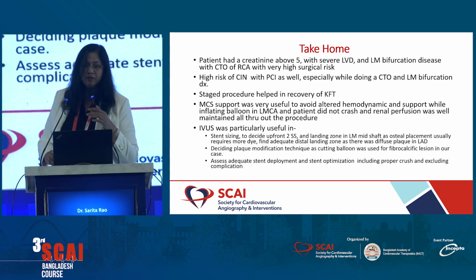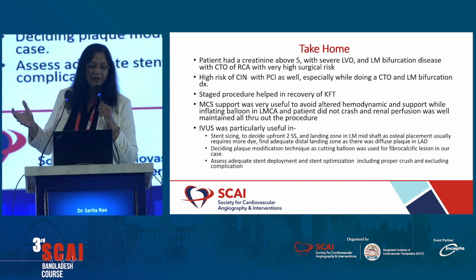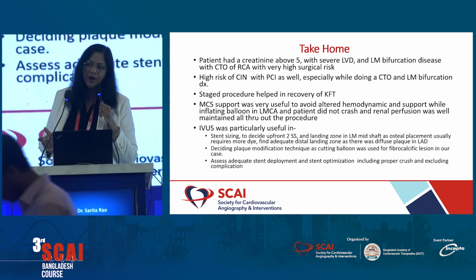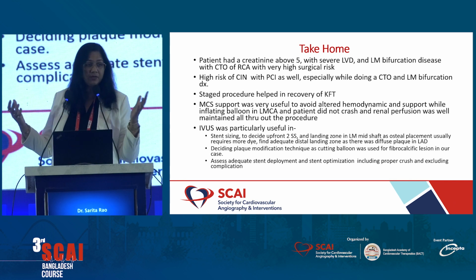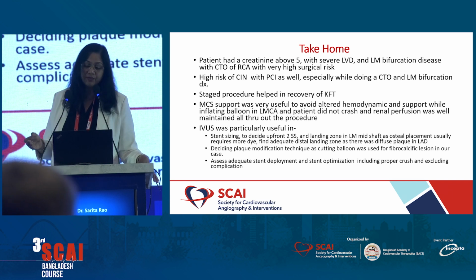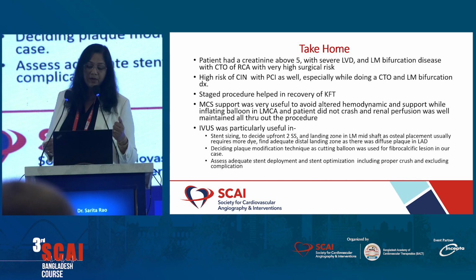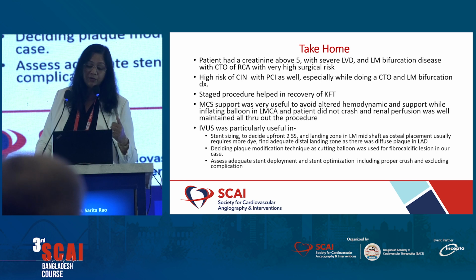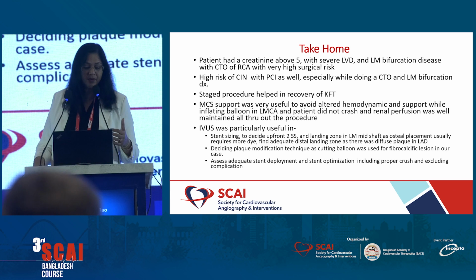So, this patient had a creatinine of above 5, severe LV dysfunction, left main bifurcation disease, CTO of the RCA, very high surgical risk, high risk of a contrast-induced nephropathy with PCI as well, especially while doing a CTO and a left main bifurcation. Staging the procedure helped in recovery of his kidney function tests. Mechanical support was very important to avoid altered hemodynamics while inflating the balloon in the left main. The patient did not crash during the procedure. Renal perfusion was well maintained all throughout the procedure because of the impeller support.